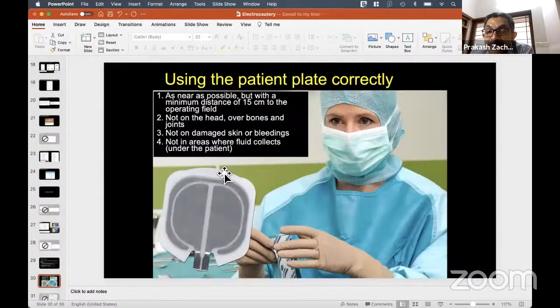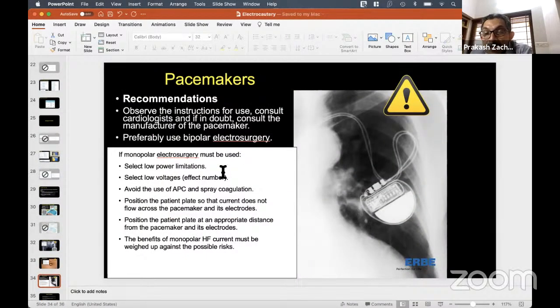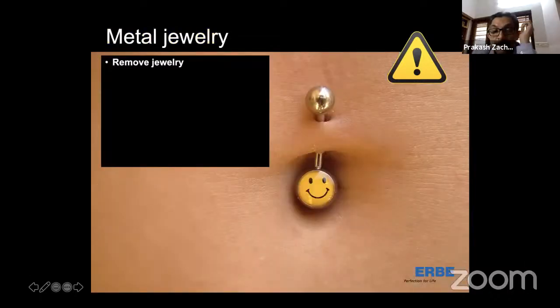It has to be on the muscle, and there should not be any hair, because that's very important. And also, you would agree that before we subject a patient to electrocautery procedures, we should inquire whether they have an implantable device, especially any permanent pacemakers or defibrillators, so that should also be kept in mind. All the modes need to be changed prior to this. So that was just something which I added.